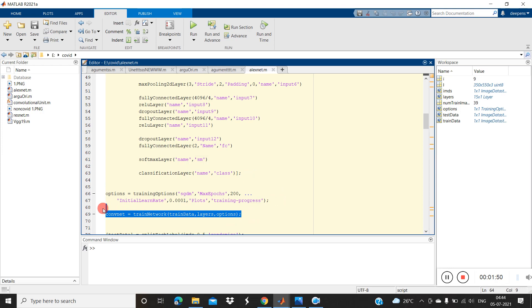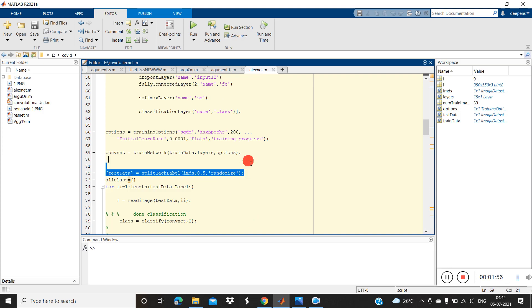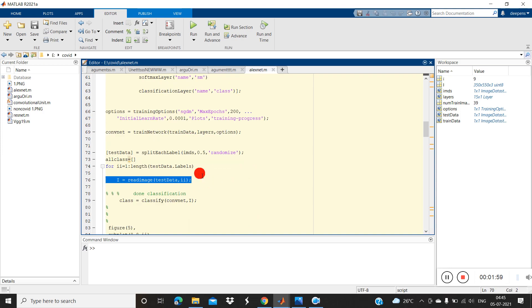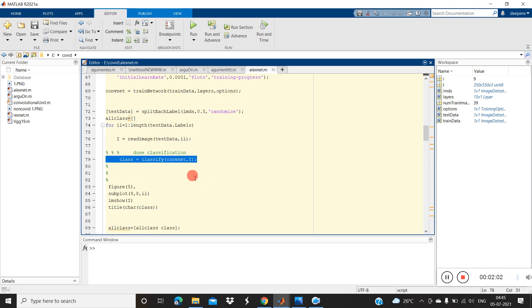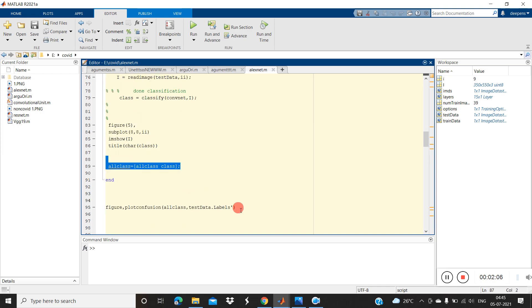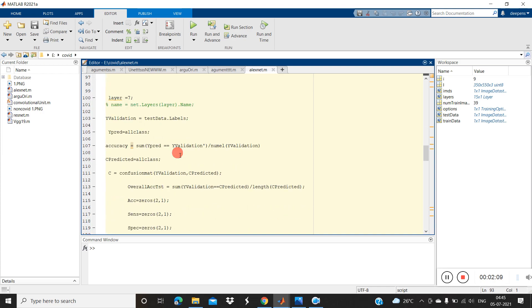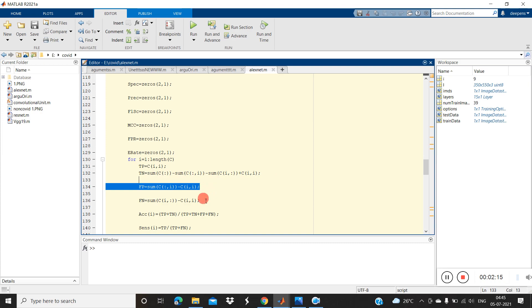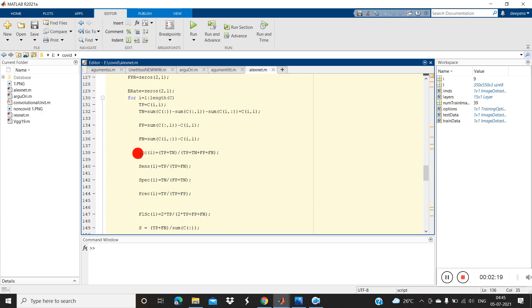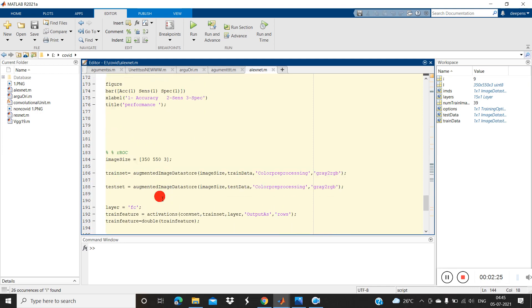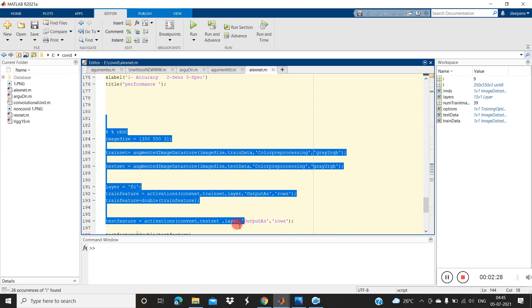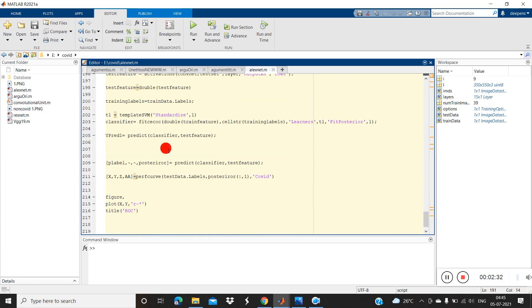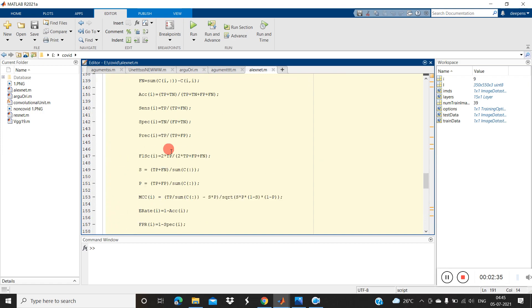Provide the training options, then train the network using the train network function. Split the testing data, read each image and classify it. Finally, save all the outcomes, then plot the confusion matrix. Find the accuracy by computing true positive, true negative, false positive, and false negative. Using these parameters we can calculate accuracy, sensitivity, specificity, and precision. Finally, we can also find the ROC curve.